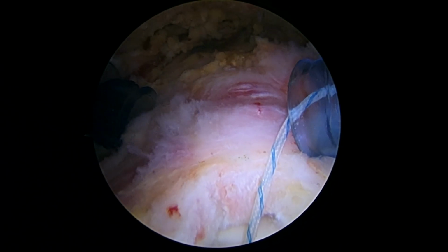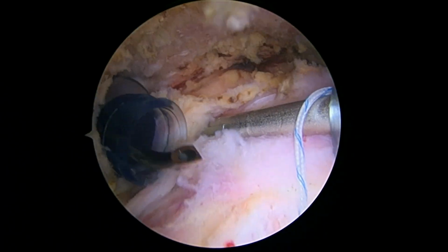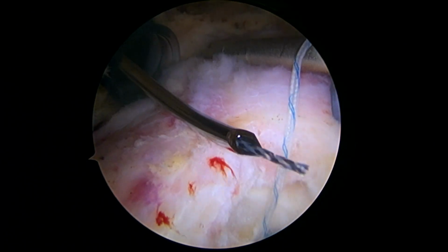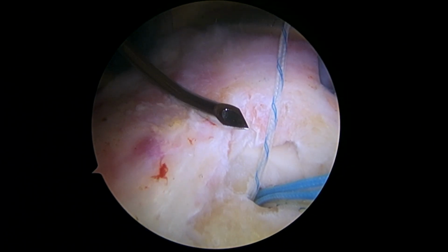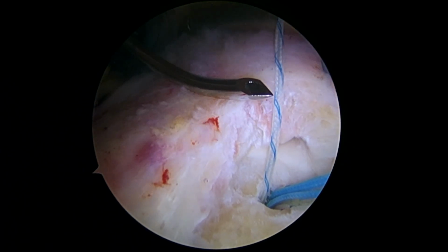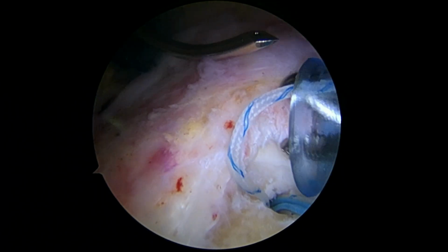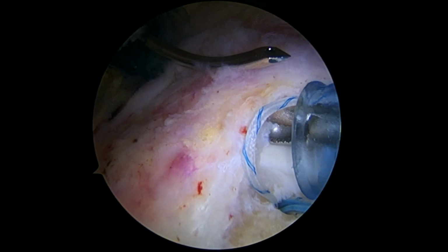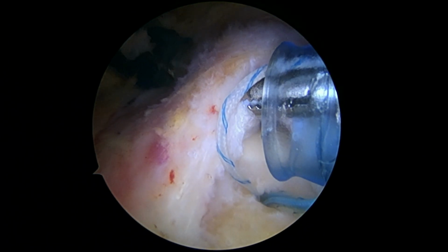And we'll take the straight crescent suture hook in the back. So here's the suture hook. It's loaded with a black wire called a super shuttle. You can see that. And now you're on the camera, 2 hands. One on the light cord. And we're going to use this little grasper to help us. We're going to make sure we get the full thickness of this tendon here, like that. I'm going to start back here.